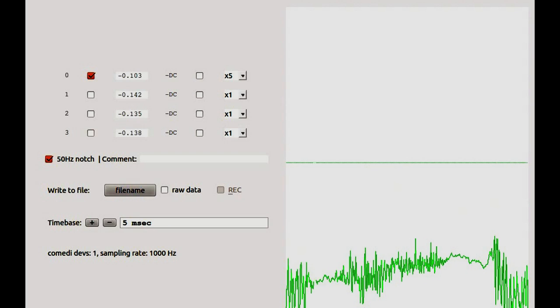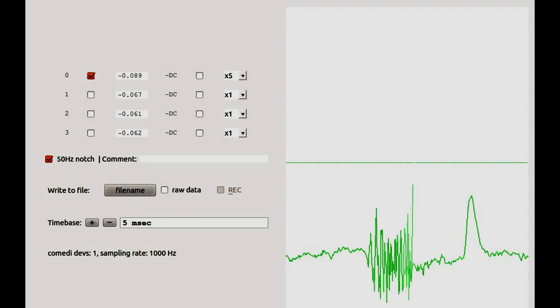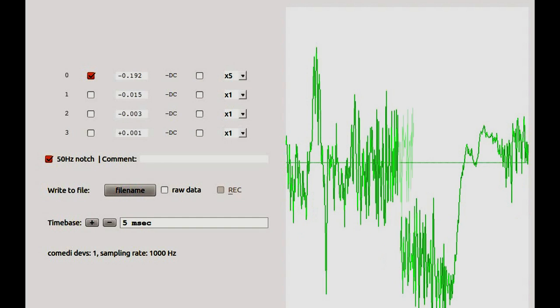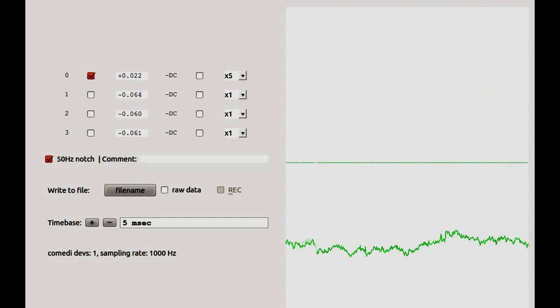So EMG, we can show you what that looks like stronger. So if you move your facial muscles, like smile or do some expressions, we'll be able to see the EMG signal a lot stronger. That's good. Yeah, so we're seeing a much stronger signal now on top that's 10 to 100 times larger than we would expect your EEG signal to be. Right, so just basically the smile has completely overshadowed the EEG, yeah? Yeah, that's right.